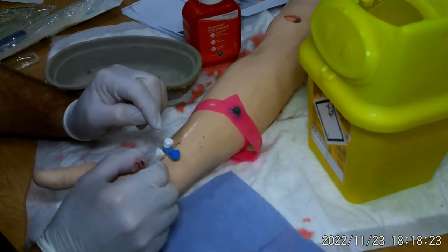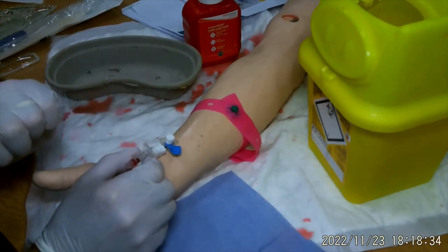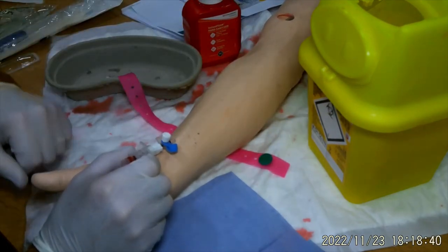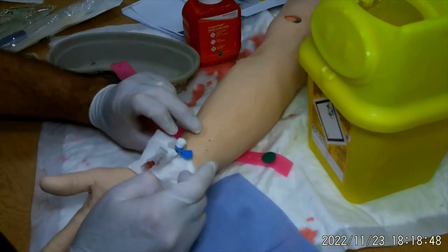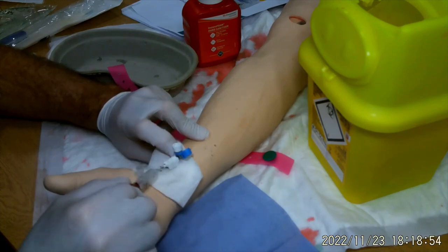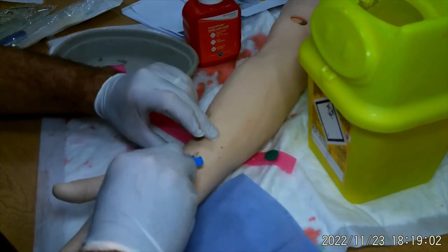I've got my second flashback coming up here now, and as that comes up I carry on advancing the cannula all the way until it touches the skin. I've held the needle still at all times. This is the stage when the tourniquet should come off — so we take that off. Now I'm going to get my gauze and place that underneath the cannula to mop up any mess. I'm going to occlude to the end of the vein, hold the cannula still. I'm aware my white cap is there — as I withdraw, straight into the sharps, white cap on, and that stops any flow.